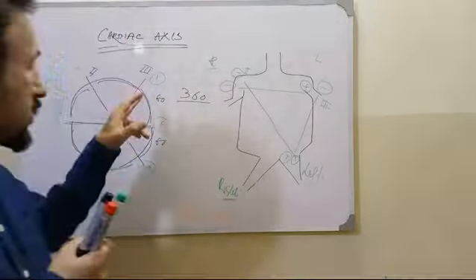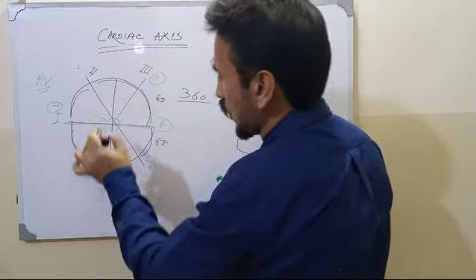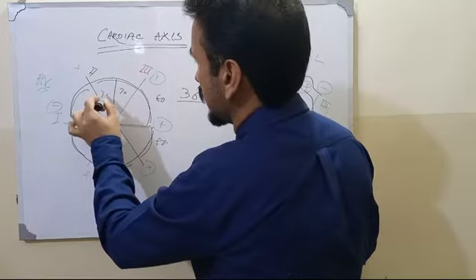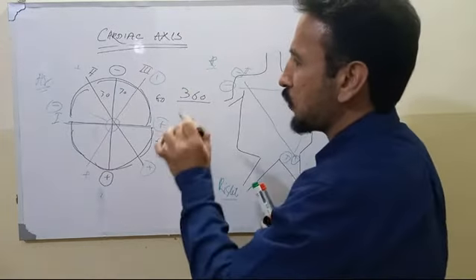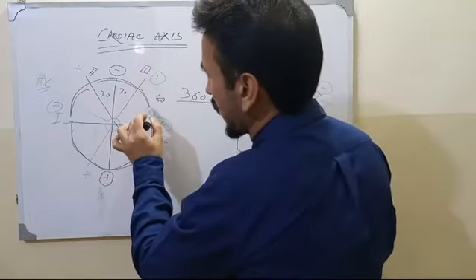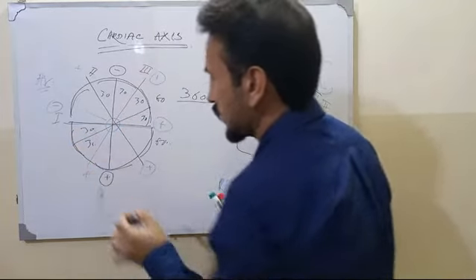So these 60 degrees are split by the augmented leads into 30 degrees like this. For example, this is the AVF, which is intersecting this 60 degrees into 30 degrees. So the negative pole is here, the positive pole is here. Again, the AVL intersects lead 3 and lead 1, making an angle of 30 degrees here, and 30 degrees here, and 30 degrees here, 30 degrees here, right?